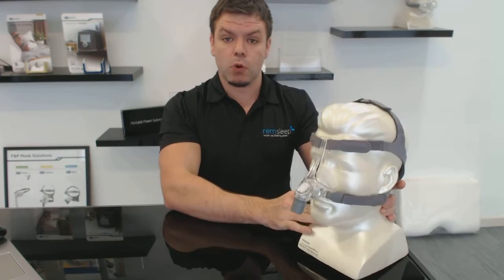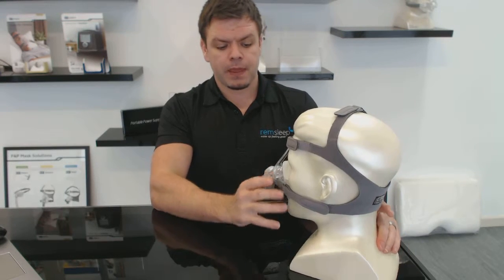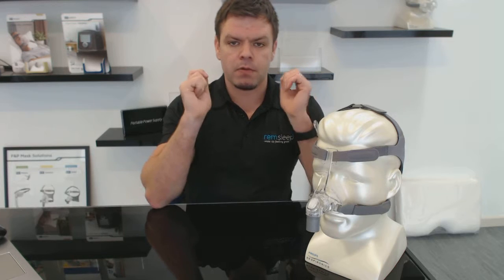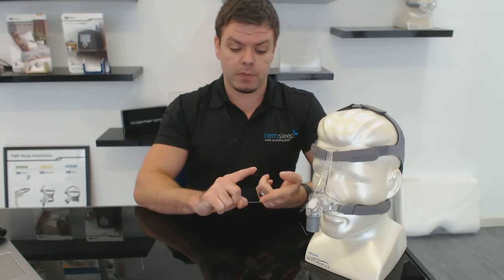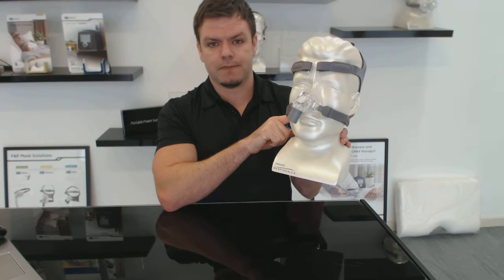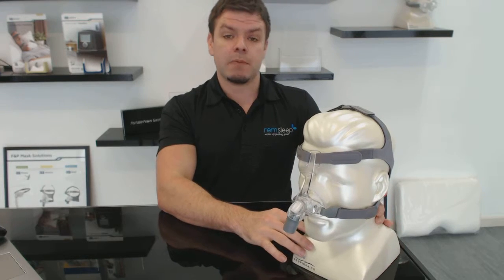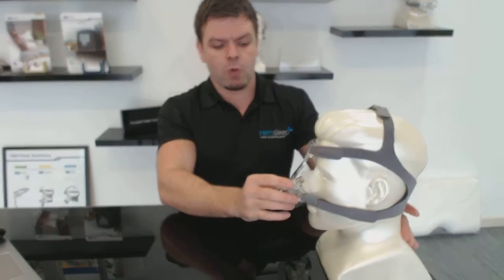The headgear comes in small and medium/large sizes. Most people are at medium to large size, but if you have a small head you might be better off getting a small size. When you buy a medium or large cushion it comes standard with medium/large headgear; when you buy a small cushion size mask it comes with small headgear. If you did get a medium/large headgear, you just pull the straps back a bit — it's not a big deal at the end of the day.